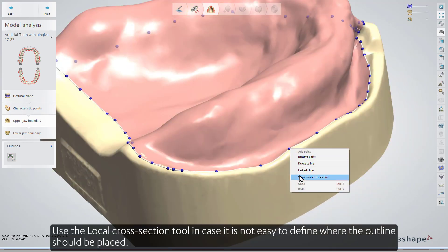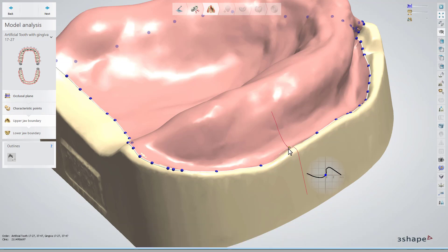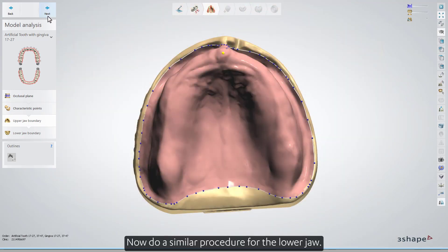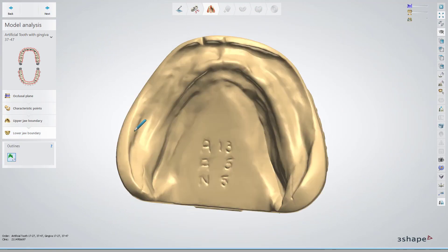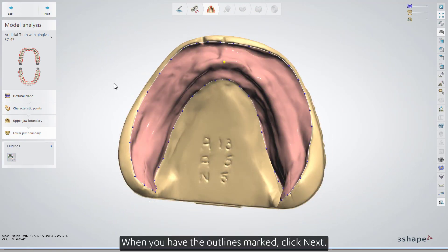Use the local cross-section tool in case it's not easy to define where the outline should be placed. Now, do a similar procedure for the lower jaw. When you have the outlines marked, click Next.